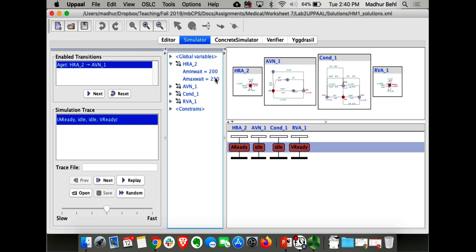And you actually did this for one of your homeworks. Remember, if you did this exercise, which was also called the 2:1 conduction, if your atria goes into tachycardia, it will pace twice as fast, but this is where the antegrade and the ERP of the AV node will come into play.